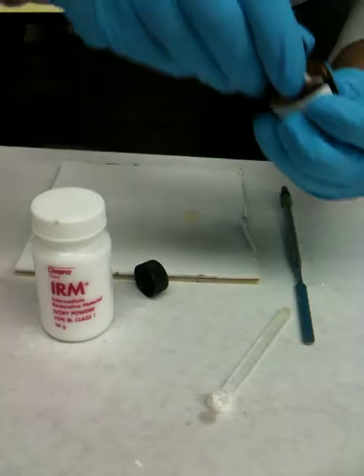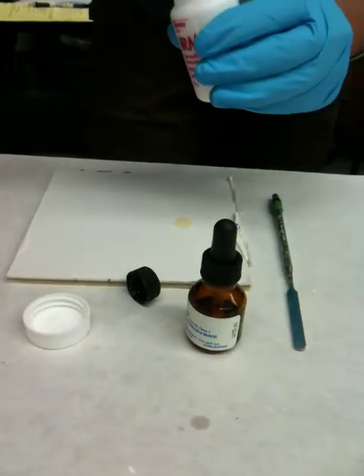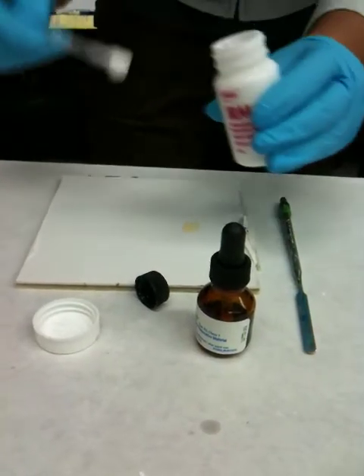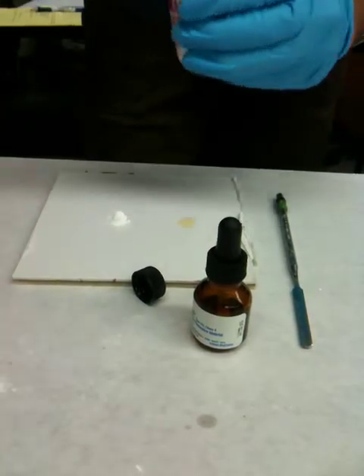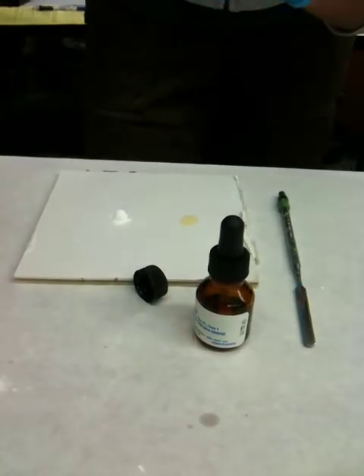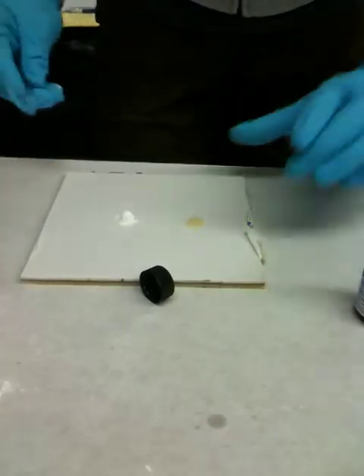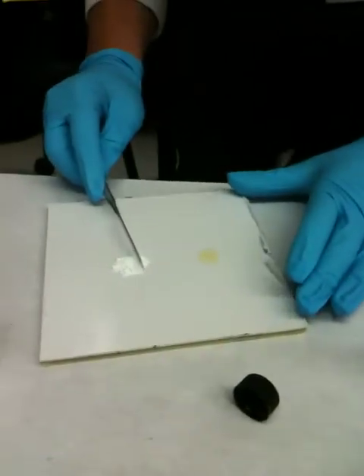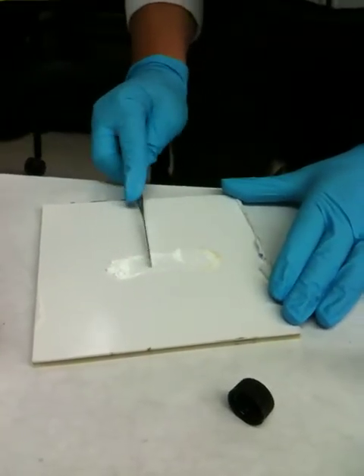Replace the cap afterwards, then you're going to put two to five scoops of the IRM. Replace both caps afterwards. You're going to mix it till it's smooth and creamy, so start slowly mixing the powder.